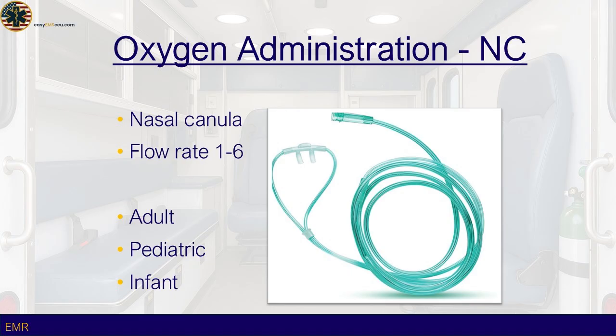Additionally, nasal cannulas can be used in conjunction with other oxygen delivery methods, such as non-rebreather masks or CPAP devices, when higher oxygen concentrations are required. They are also valuable for patients who cannot tolerate a mask due to anxiety, facial trauma, or claustrophobia, making them a versatile tool in the EMS oxygen therapy arsenal. Despite their benefits, nasal cannulas have limitations that EMS personnel must consider.